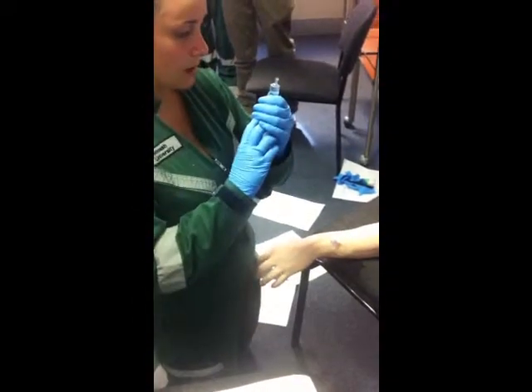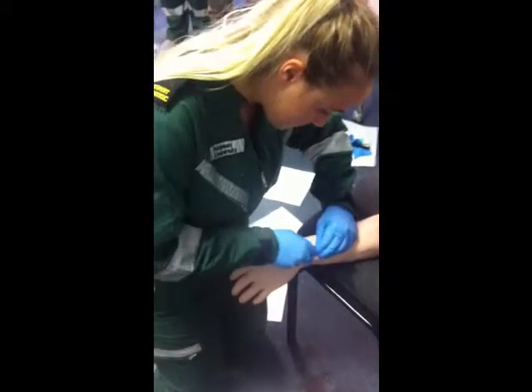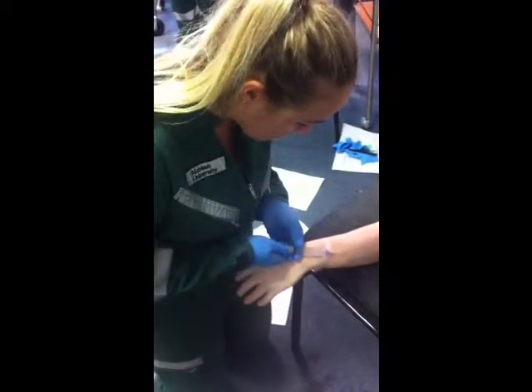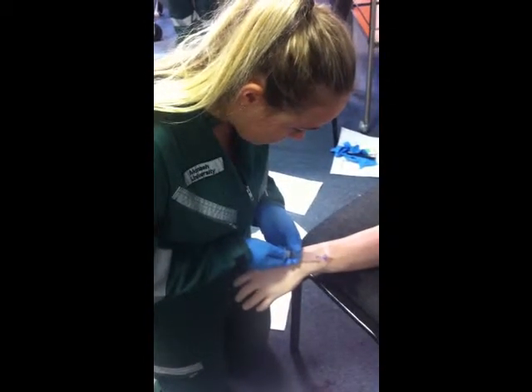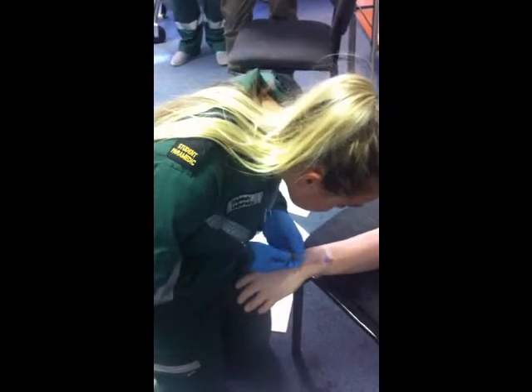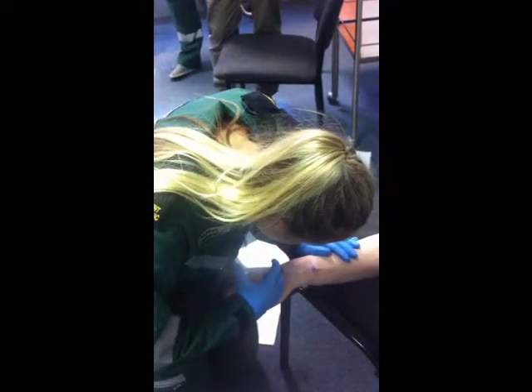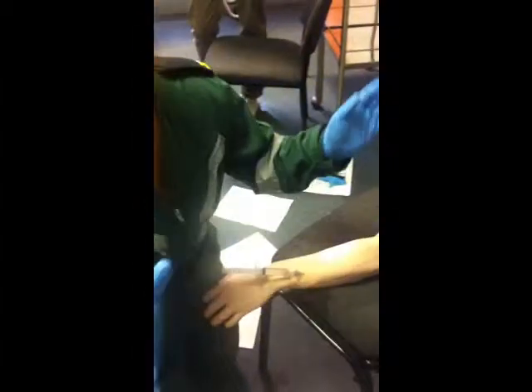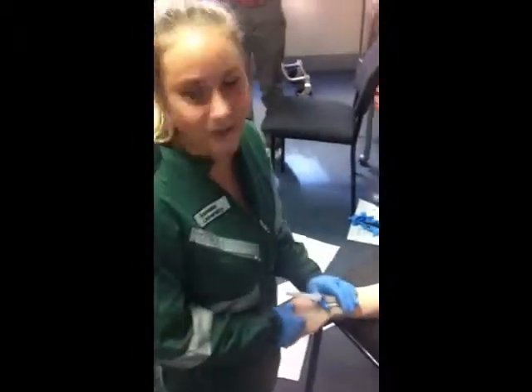Make sure there's no air. So drill back slightly. Let's see. I'm actually going to flush because it's just too messy. That's it.